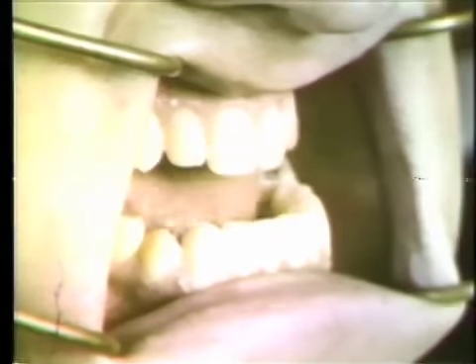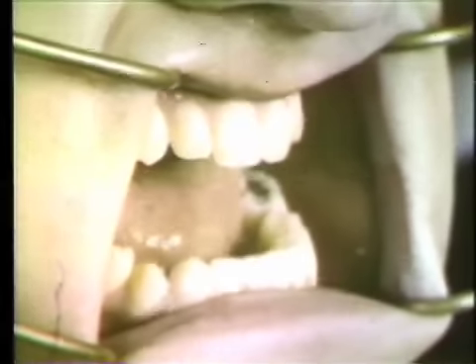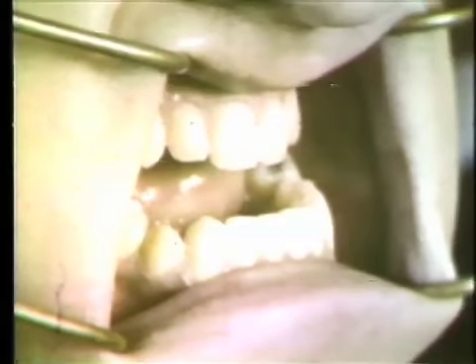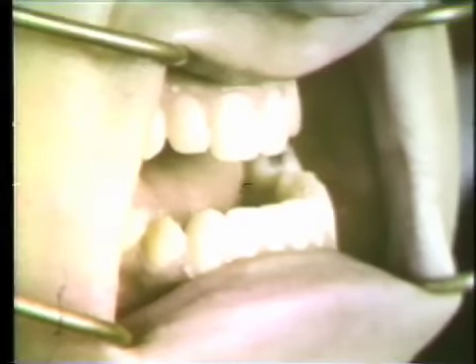We can see the limited functional occlusion here with contact only on the second molars. The second molar occlusion, however, is fairly good, and through a study of the records on this case, the casts shown here suggest that the displacement of the anterior segment posteriorly and superiorly with the removal of the mandibular first molar will bring this jaw relationship into a significantly improved functional contact.